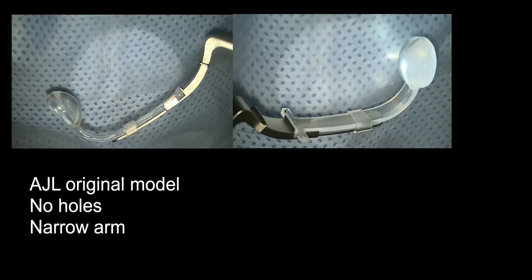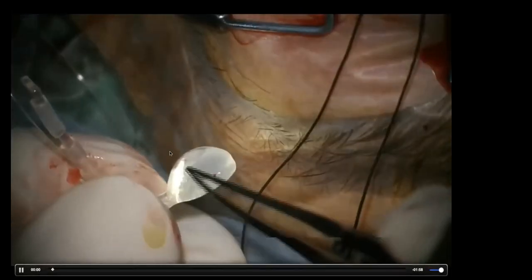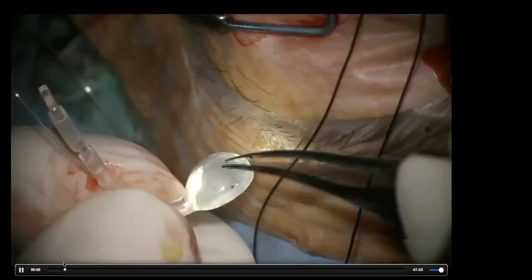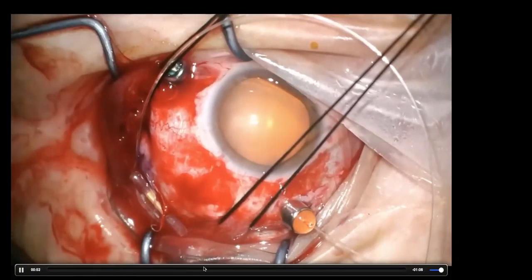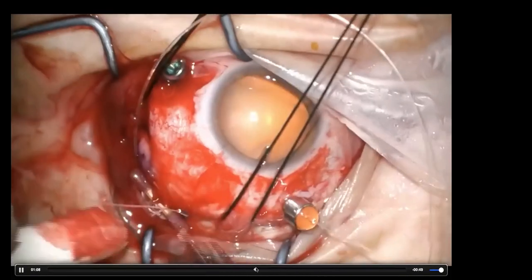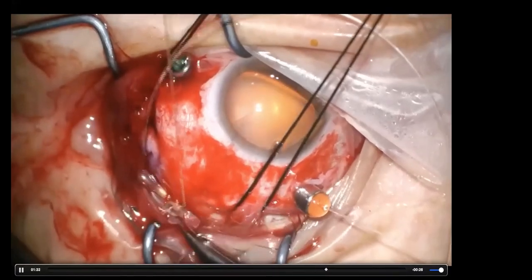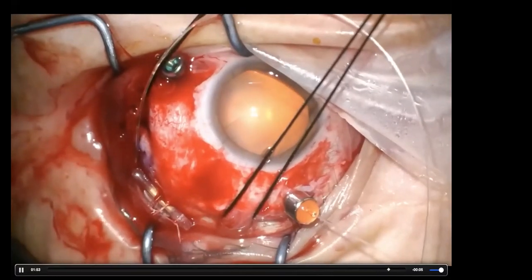The original AJL model has two lateral wings to use for the anterior suture. And here you see how it looked, how you could see the transillumination, because as you can see, a fiber optic can be implanted behind the head of the buckle. And this is how I used to pass the suture around the lateral wings of the macular buckle, again in the anterior area.